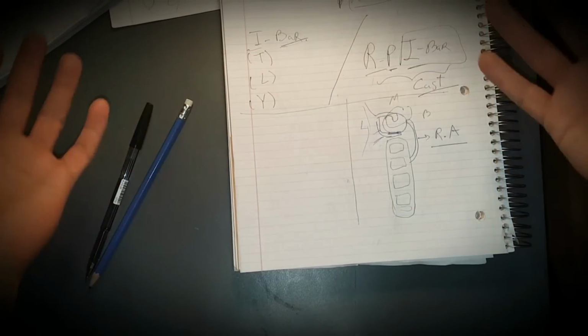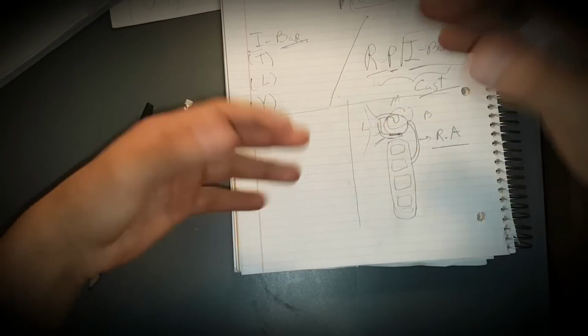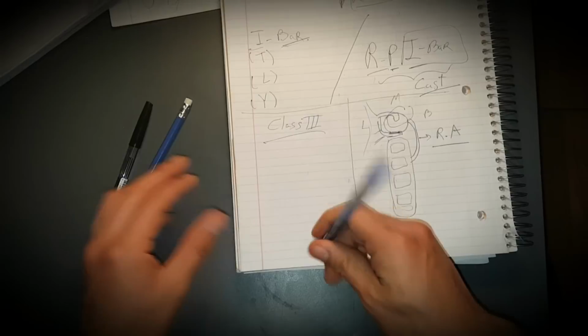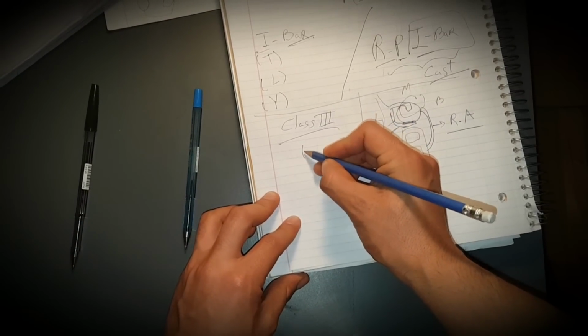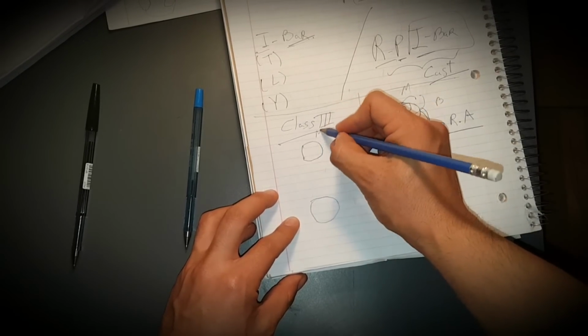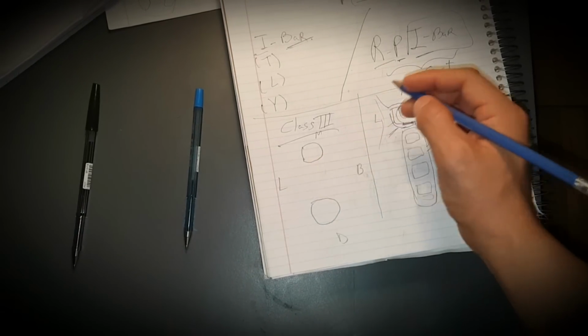Now, the I bar. This is called just an I bar. So when do we usually apply this I bar, just the I bar and not the RPI? Usually in class 3s. I have a class 3, so I'm going to draw it here. Imagine we have a premolar, and I have a molar here. So this is again the mesial, the distal, this is buccal, and this is lingual.